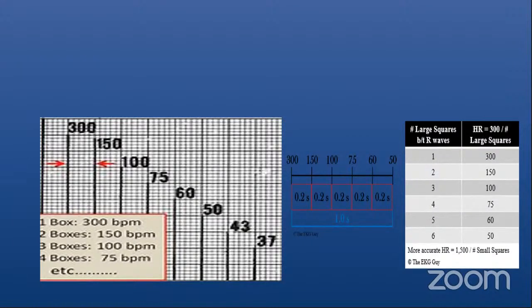Yeah, obviously, to be honest, if you're resuscitating any child, even a newborn, you should have the ECG. Without having an ECG, how can you resuscitate a child? So you should have the ECG, or at least on the monitor or on the defibrillator, some sort of a rhythm read happening. Otherwise, how can I resuscitate? How would I know that?